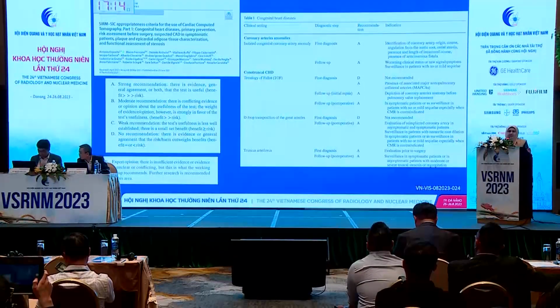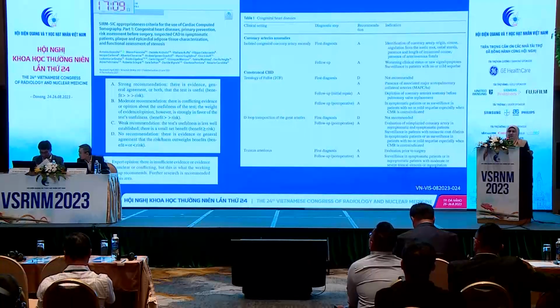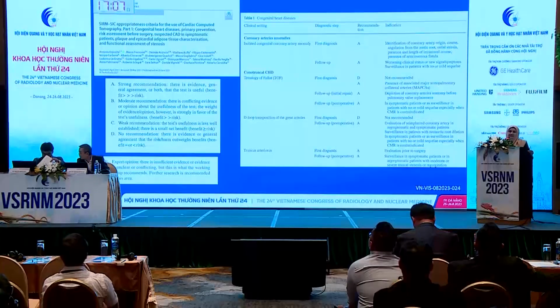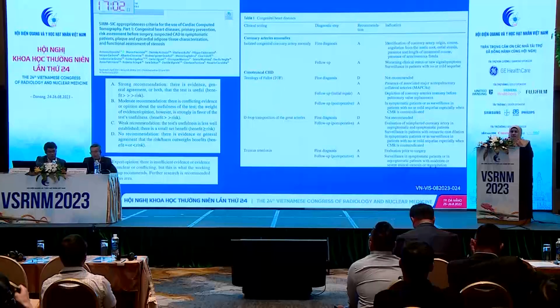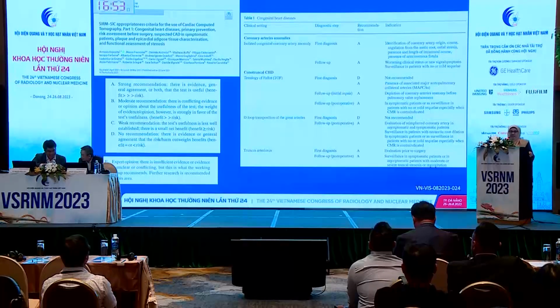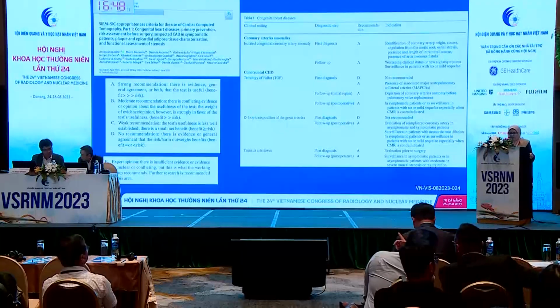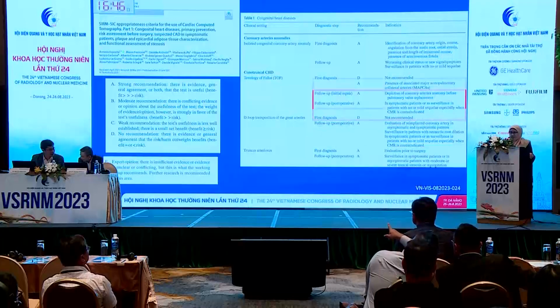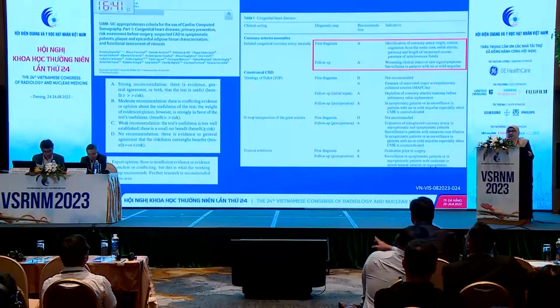I purposely put this slide because it is very important, as maybe the audience will be interested to ask: why do a CT in congenital heart? Why in babies? Why in newborns? This is a paper discussing the appropriateness criteria for the use of cardiac CT in congenital heart disease, published by the group Esposito et al. from Italy.